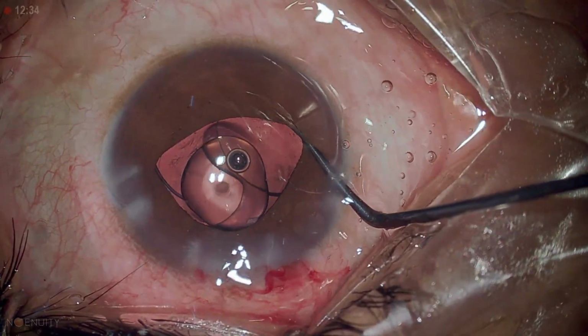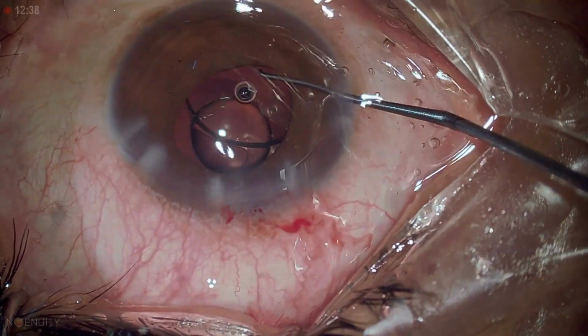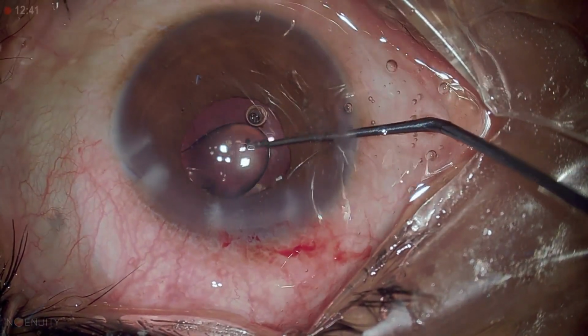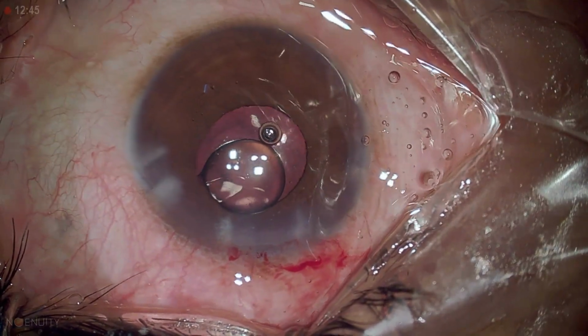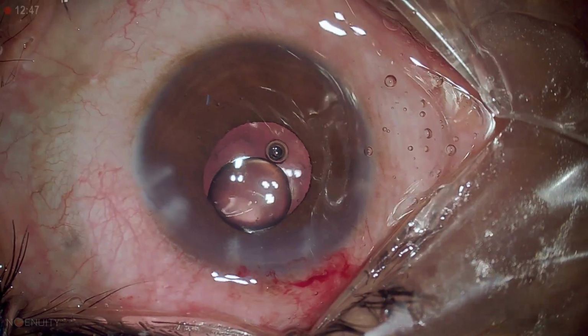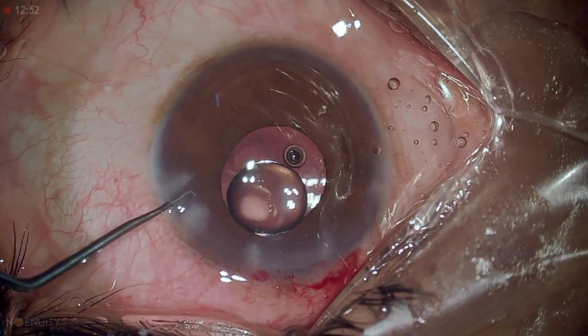The silicone oil does come out a bit, and you can actually tamponade it back again. And whatever excess oil bubble is remaining in the chamber, you can safely remove it.